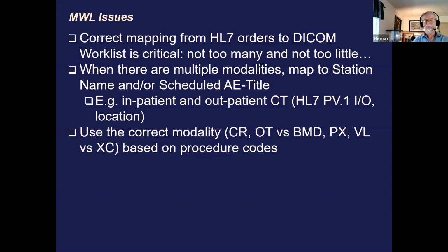I see quite a bit of variation in there. For example, if you have a DEXA scanner, what is the modality? Maybe it's almost like another DICOM trivia. The modality for a DEXA scanner is actually BMD, bone mineral densitometry. Some people have CR. So if you have CR modality for the DEXA scanner, how do you make sure that only the DEXA scan worklist entries show up on the DEXA scanner and not all of radiology? So one of the things that you can do is, when you set up devices, use the correct modality. Some of the tricky ones are DEXA scans, use BMD.